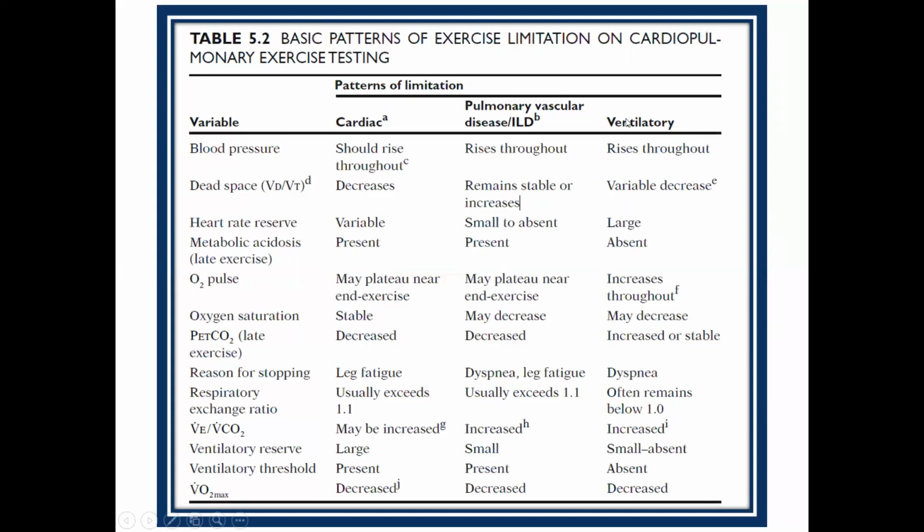Heart rate reserve is large. What do you mean by that? What I mean by that is, in a ventilatory limitation, by definition, you're saying that the patient is limited by their lung well before their heart gets out. So in other words, their heart rate reserve will be pretty good.